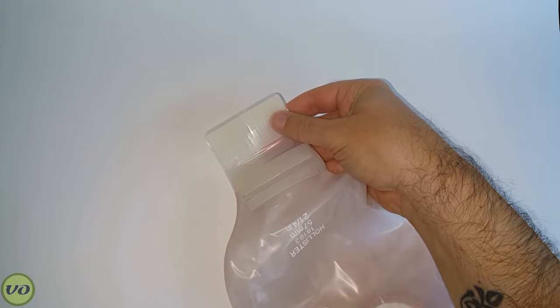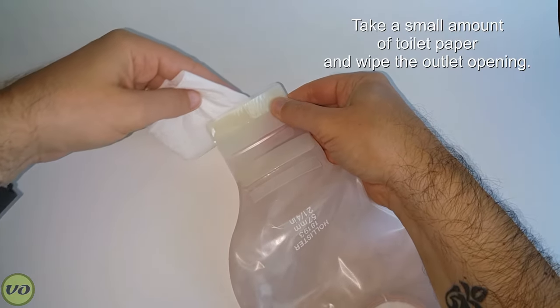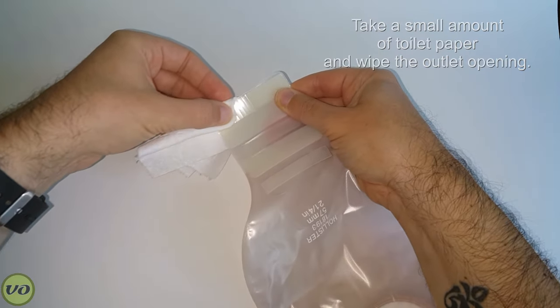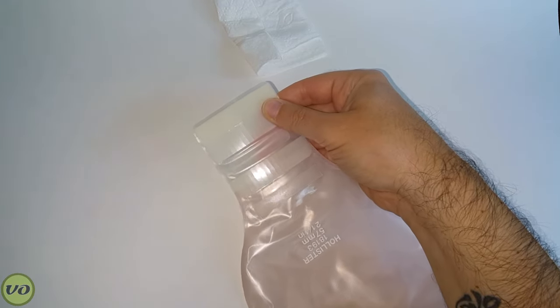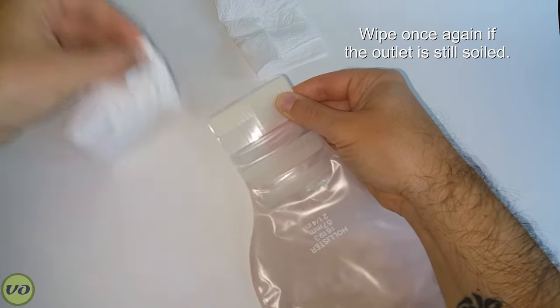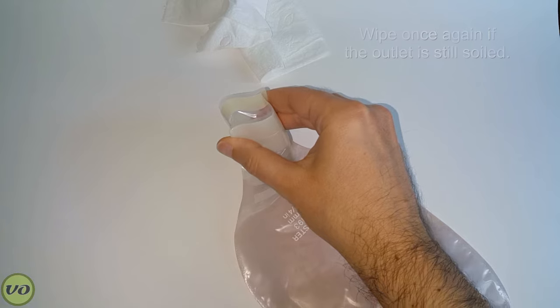Now once the stool is out, what I generally do is I'll take a piece of toilet paper, I'll clean the top of the outlet, and I may do this a couple times depending on how soiled that outlet becomes. But that allows me to just clean it up for when I actually open it up.